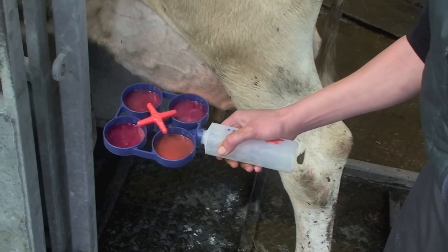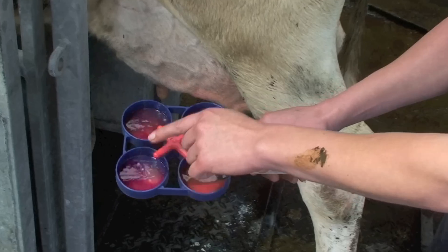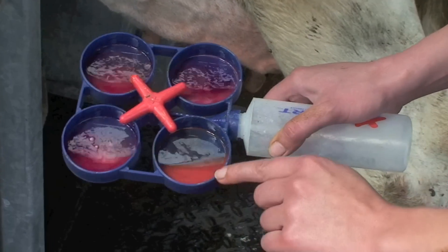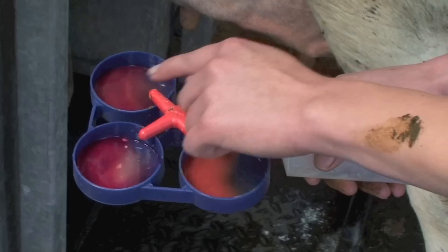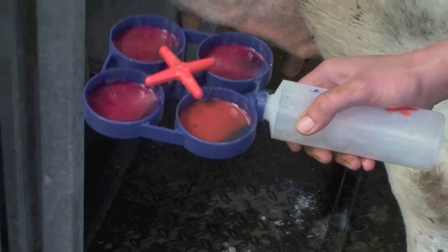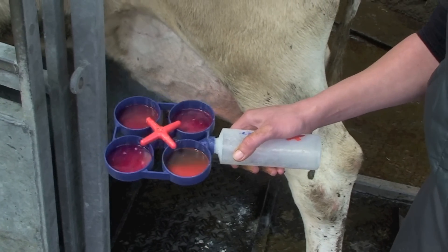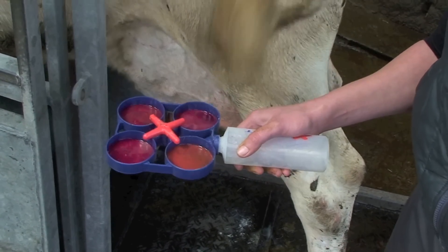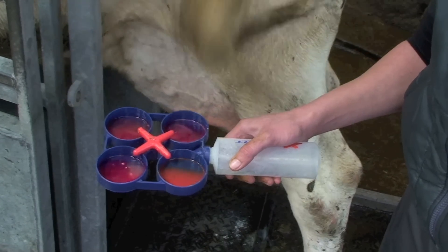We swirl this round and look for a gel-type reaction. You can see that these have all gelled up, whereas this one looks more milky and is easier to swirl around the paddle. These three are showing positive reactions, which means they have a cell count in the region of 400,000 or higher. This can form the basis of either our treatment or further sampling for the cow.